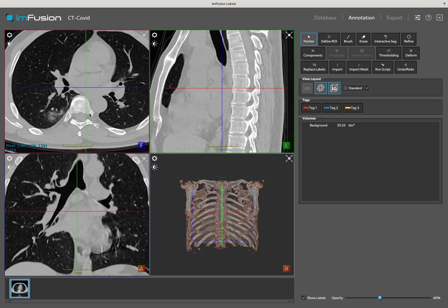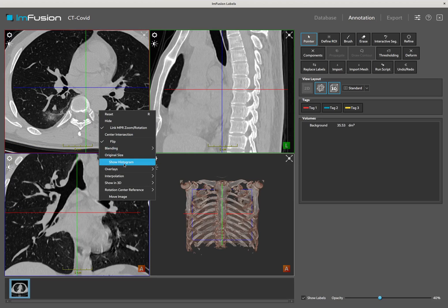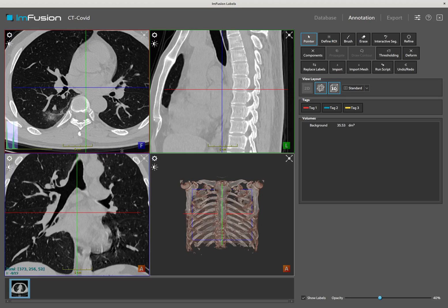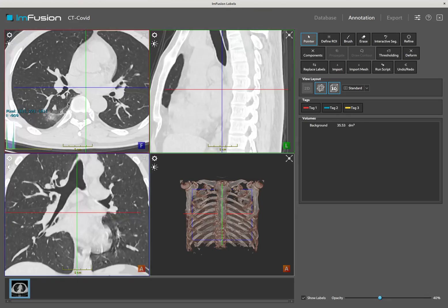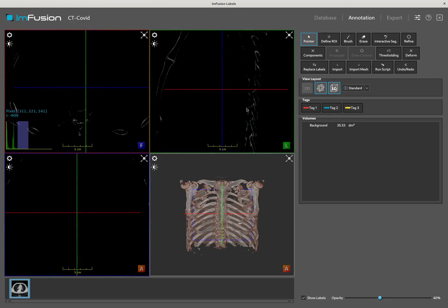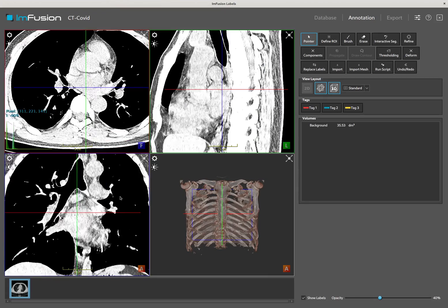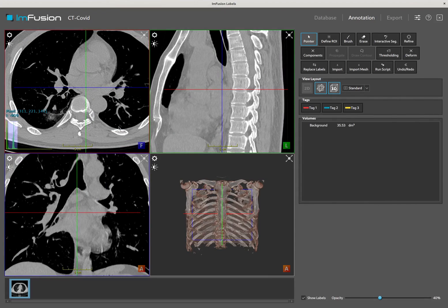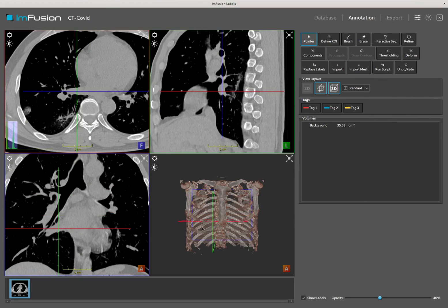The windowing applied to the image can be controlled in a similar manner. I will enable the histogram to illustrate the changes. To change the windowing, I must first hold the Shift key on the keyboard. Then, holding the left mouse button and moving the cursor sideways will change the level of the window. Moving the cursor up and down will instead affect the width of the window. Finally, double clicking in any of the views can be used to center the MPRs on the target location.